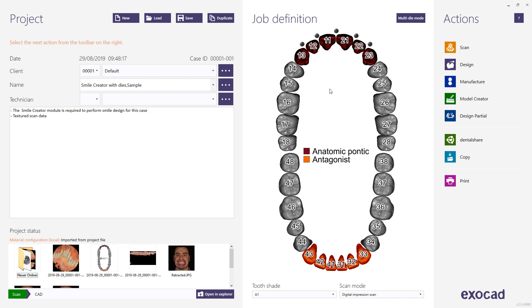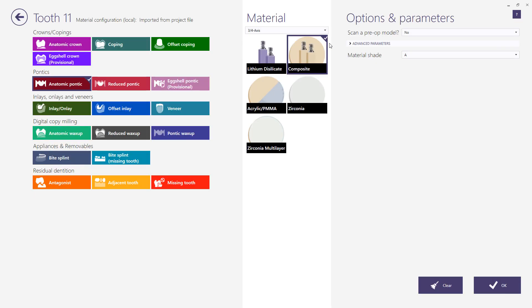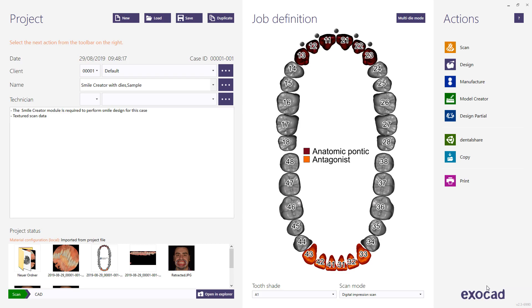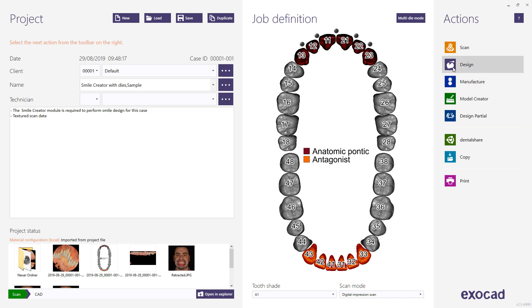We will start with one of our demo samples. The restoration type selected for this case is Anatomic Pontic with Composite as the material. The job definition includes Antagonist. Next, choose Design from the action menu to start the CAD application.